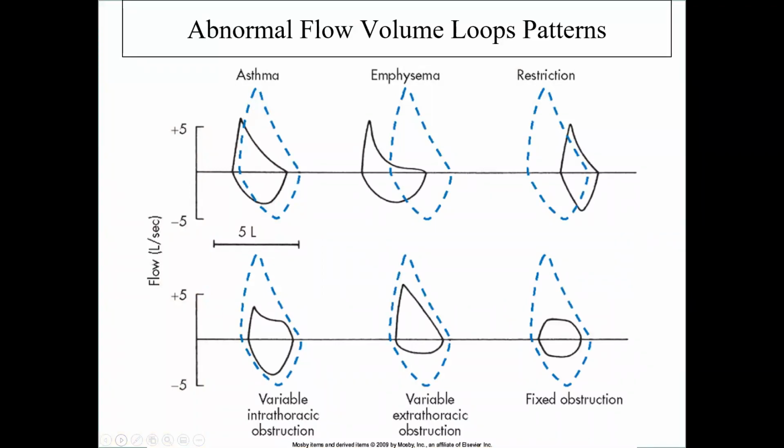When I taught respiratory full time, we really liked to take a look at what some of these disorders look like. I'm not going to cover each and every one of these, but I will show you a few. Let's take the top center there, emphysema. The dotted line would be a relatively normal flow volume loop.